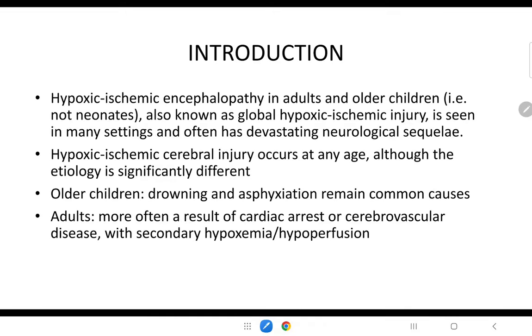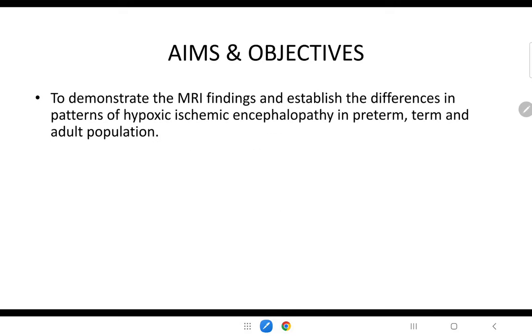Introduction. Hypoxic ischemic encephalopathy in adults and older children, also known as global hypoxic ischemic injury, is seen in many settings and often has a devastating neurological sequelae. Hypoxic ischemic cerebral injury occurs at any age. Although the etiology is significantly different, older children are most commonly affected due to drowning and asphyxiation, and adults often as a result of cardiac arrest or cerebrovascular disease with secondary hypoxemia or hypoperfusion.